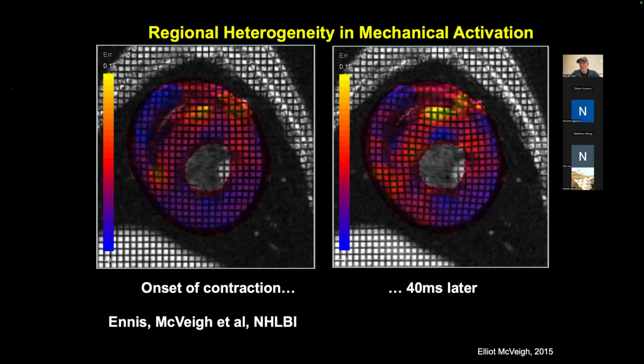And they actually did it in patients who were undergoing heart transplants. They actually put the tantalum screws into the heart that they got, right? And I'd love to see the IRB on that one.